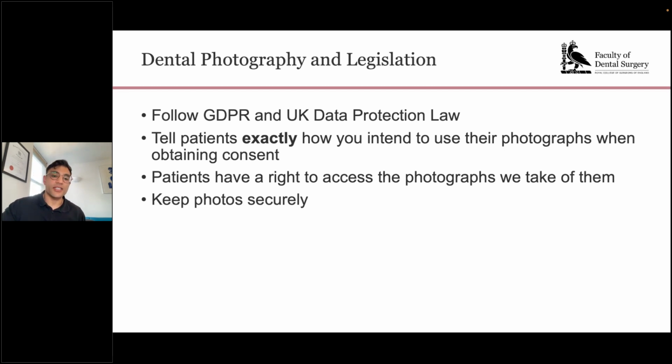And patients have a right to access the photographs that we take of them, but they need to be able to ask for these photographs in an explicit way, not just verbally. And we need to be able to provide these to them when they do ask for them. And patients frequently do. And it's not necessarily a bad thing, because what it allows you to do is demonstrate what you've done for this patient over the months and possibly years that you've seen them and what you've achieved with your orthodontics or your dentistry. And you've got to keep your photos secure. So on password protected memory cards, or ideally on a password protected server that's securely backed up.